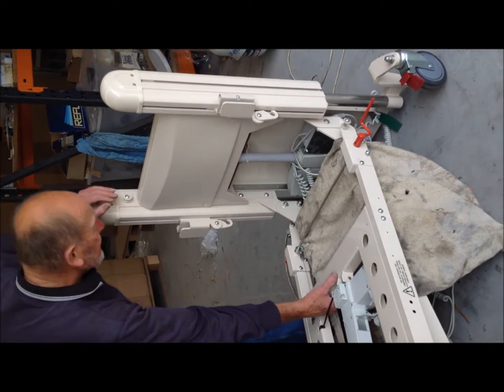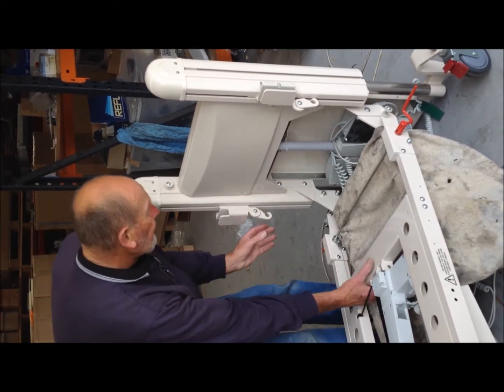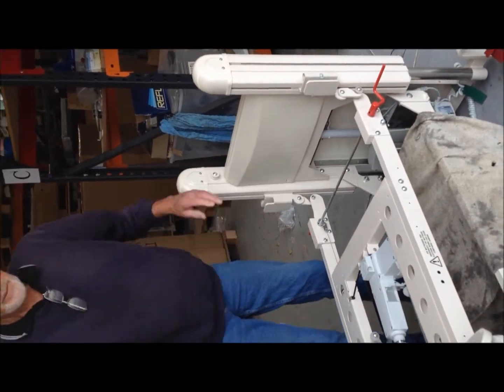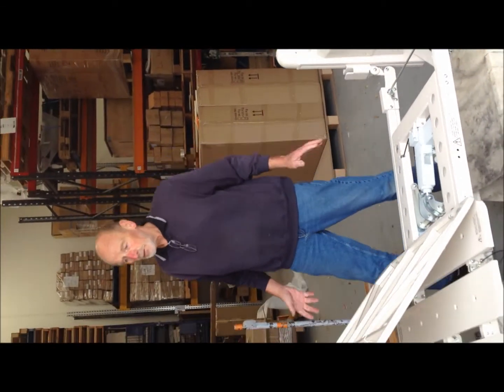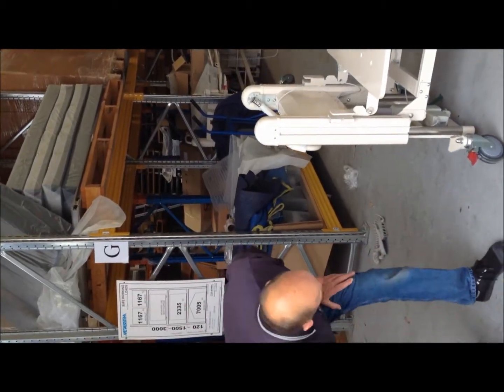I pick the bed up from the centre, and these are growth links. And when they come up, you just hook them on, like so. This one too. Now the mattress platform's on. All we've got now to do is do up these bolts. Again, I use the tool.